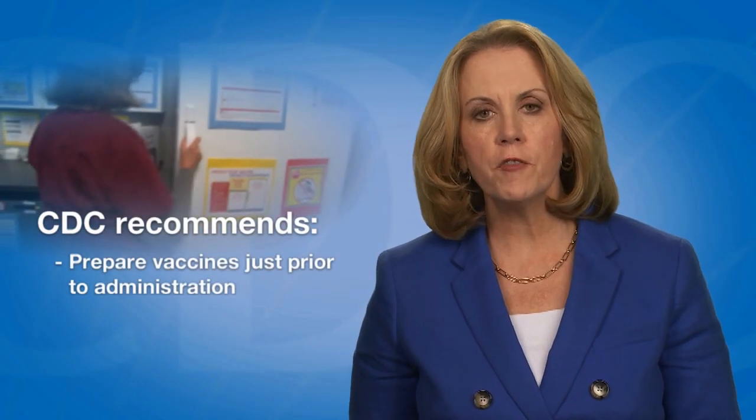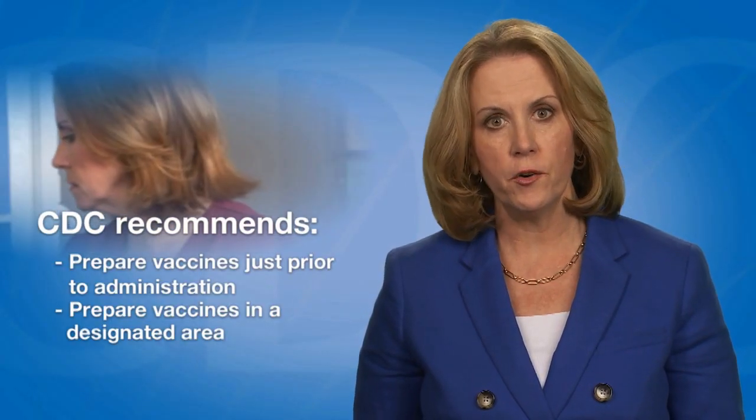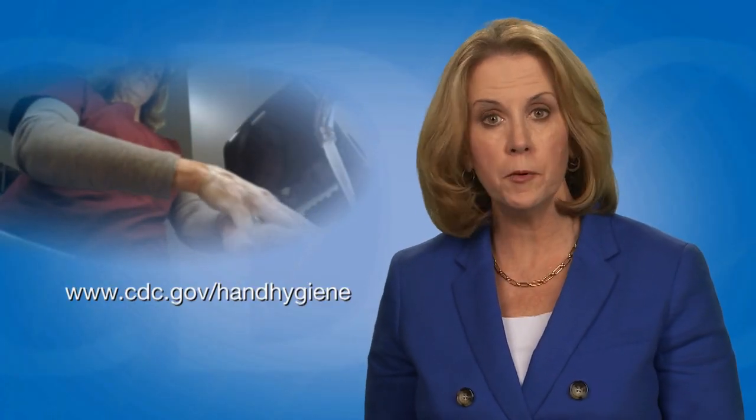Steps include gathering necessary supplies and selecting an appropriate syringe and needle. CDC recommends providers prepare vaccines just prior to administration. Providers should prepare vaccines in a designated area that is not adjacent to any area where potentially contaminated items are placed. Before preparing or administering any vaccine, always start with proper hand hygiene. CDC has hand hygiene guidelines and resources for health care personnel available online.